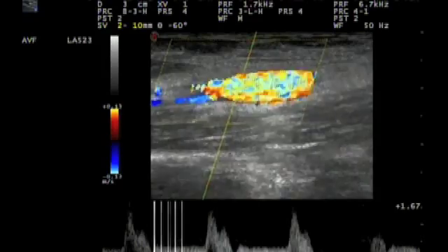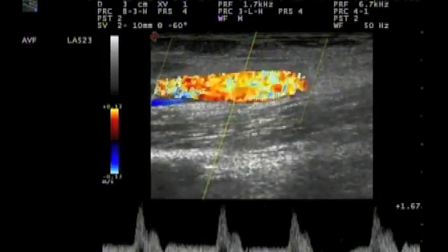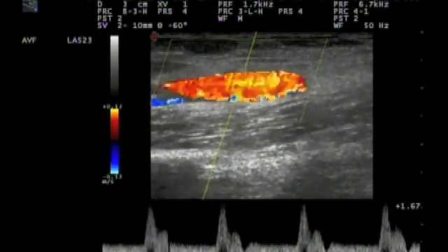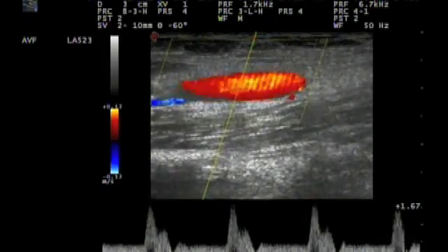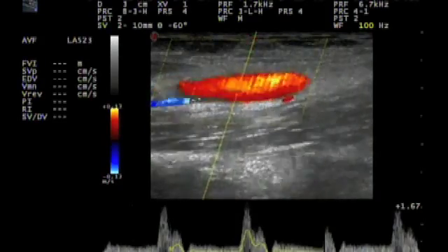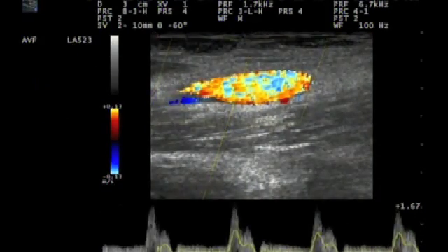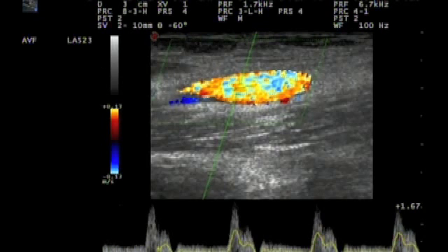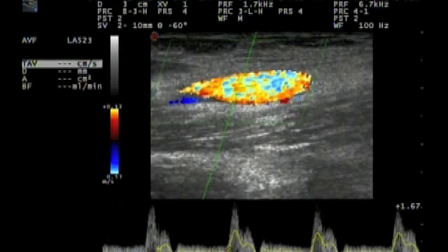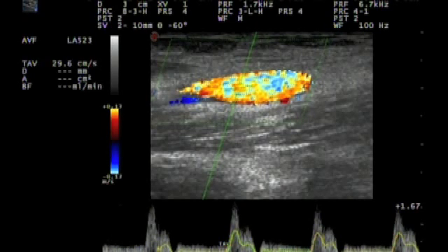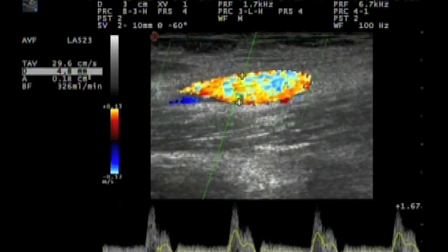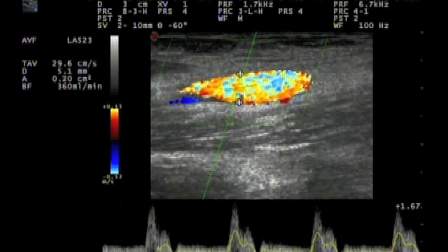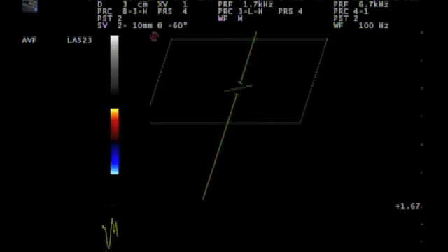Now we will measure the volume flow in the artery. We use for this measurement the time averaged mean velocity, which we mark here. And then we will measure the diameter of the artery. Then our software will calculate the volume flow, which is here 360 milliliters per minute, which is too low.